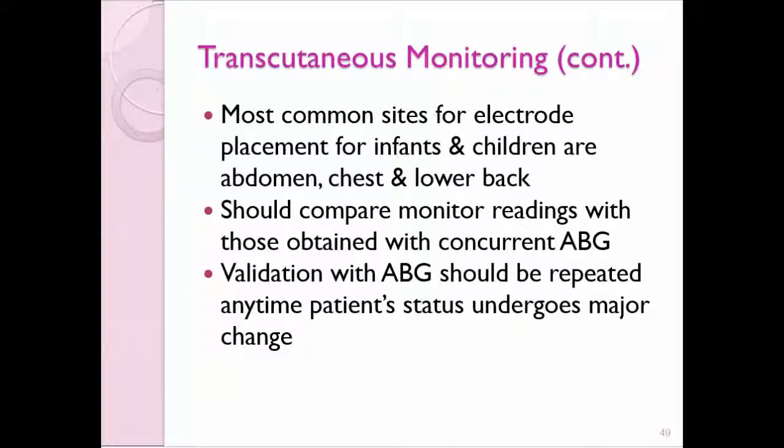You should compare the monitor reading with those obtained with the concurrent ABG. So that's why you check your validity there: you compare the actual reading at the time that you draw the blood gas to the value on the blood gas and see how they correlate. So that validation with ABG should be repeated anytime the patient's status undergoes a major change.